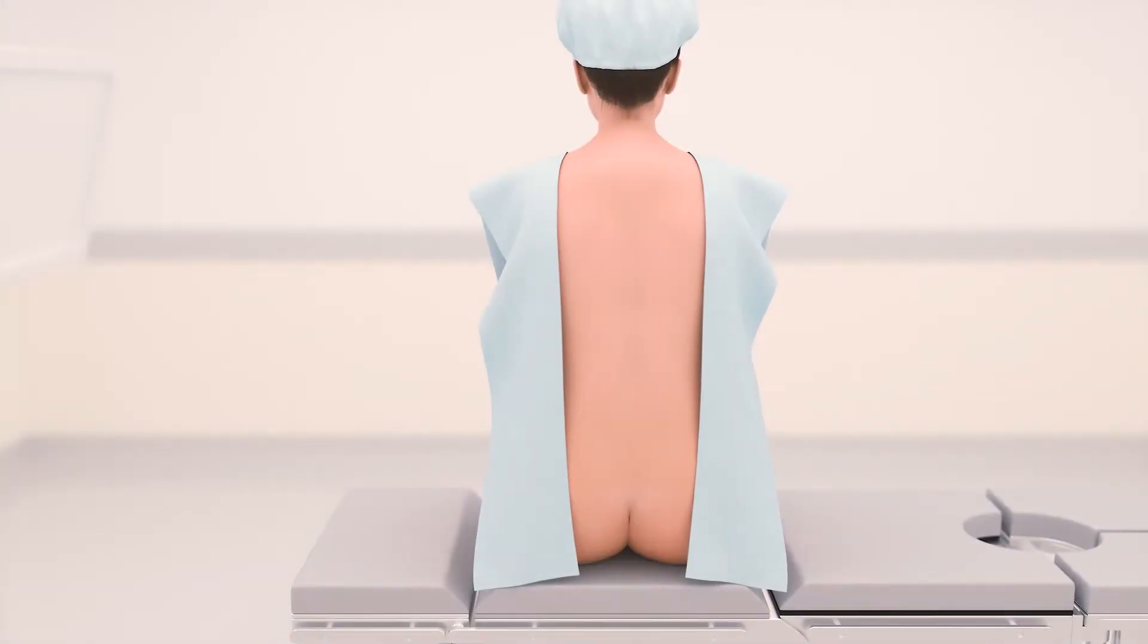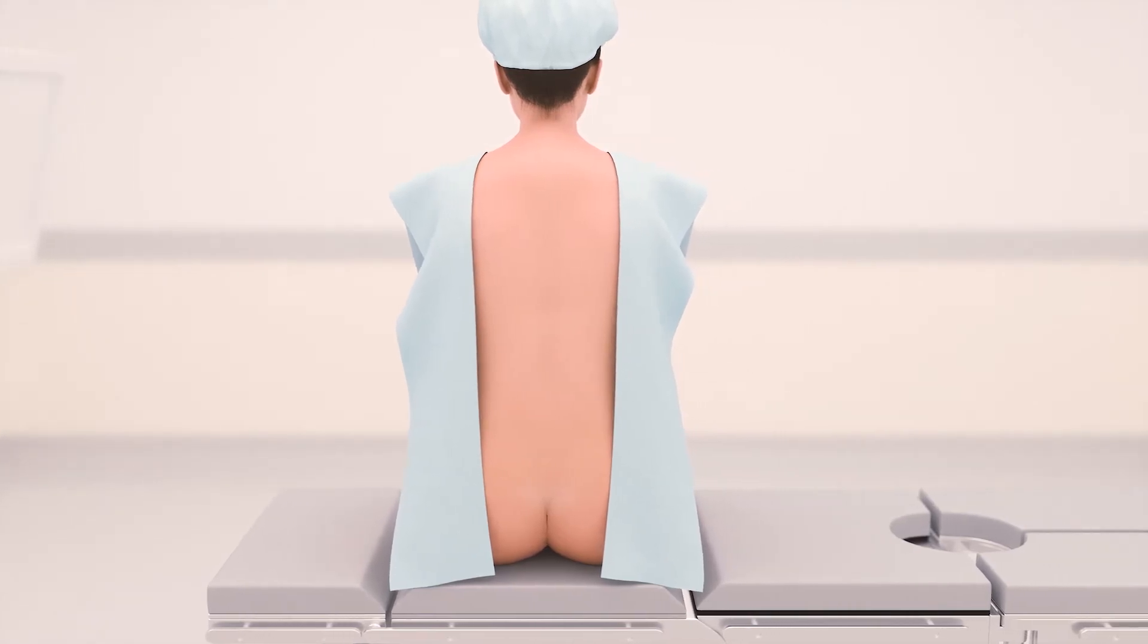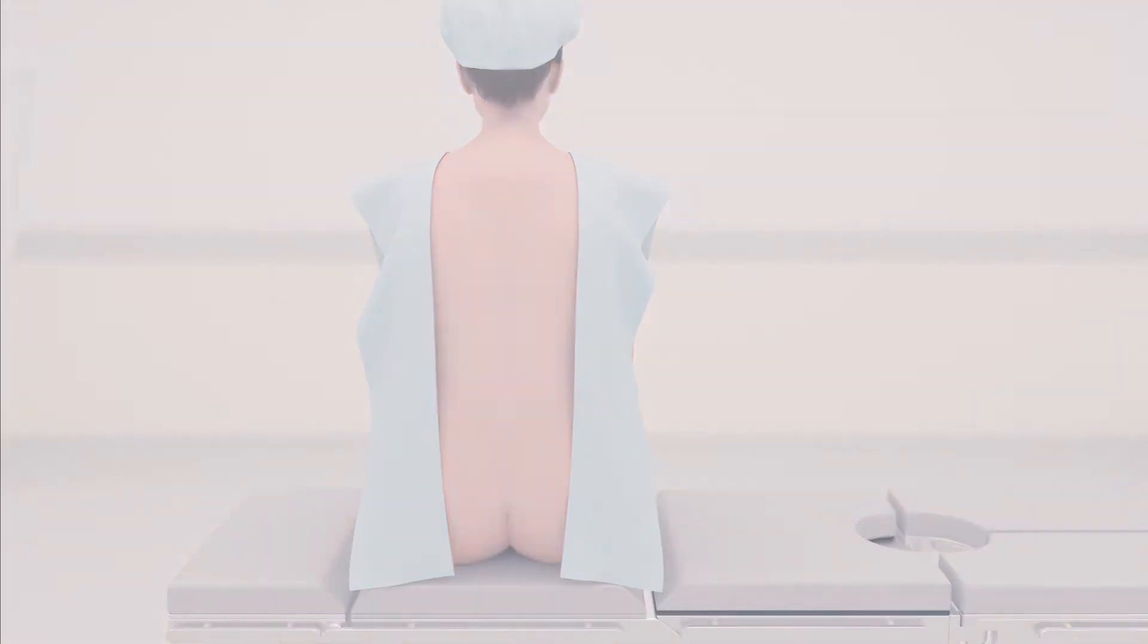The patient is marked preoperatively in the upright position, either standing or sitting. The stimulator should be placed below the iliac crest in the hollow of the ilium. Palpating the iliac crest and then measuring four centimeters caudal will give an ideal location. The stimulator stencil can be used as part of this process to mark the location.